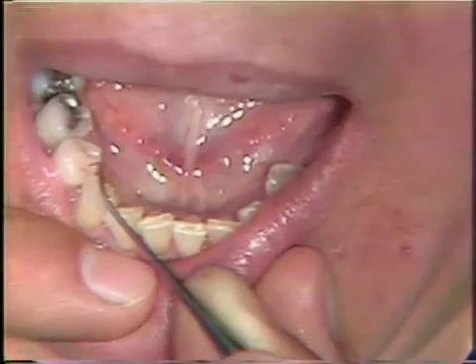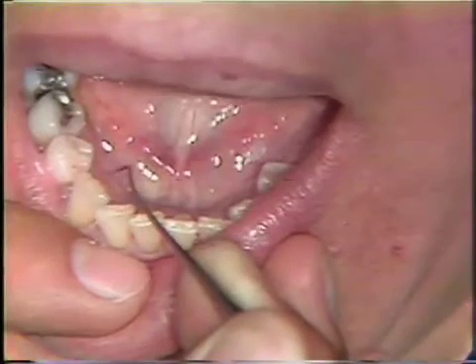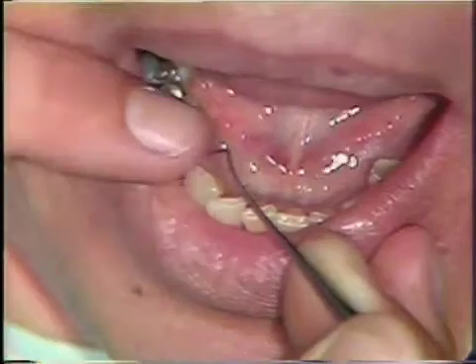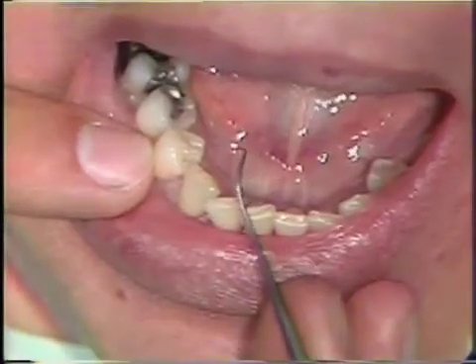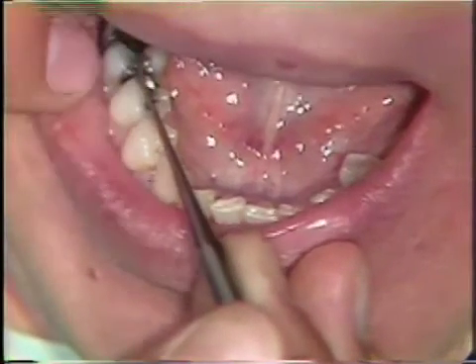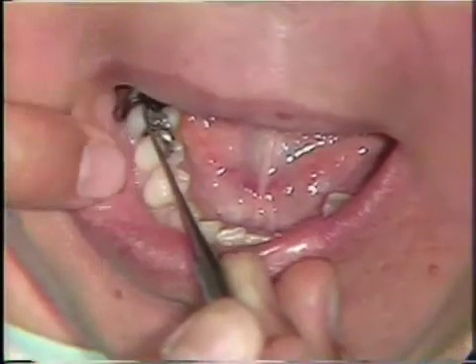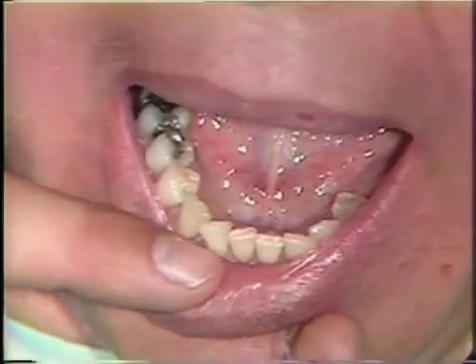We should provide access and try to project the indirect retainers coming from the lingual bar and into that rest area. If it needs a slight amount of axial reduction, that should also be done. The last rest, which is not going to be prepared now but will be placed at the time of preparation of the restored teeth — which is the molar — on the distal aspect of the molar will go our last rest for the direct retainer.